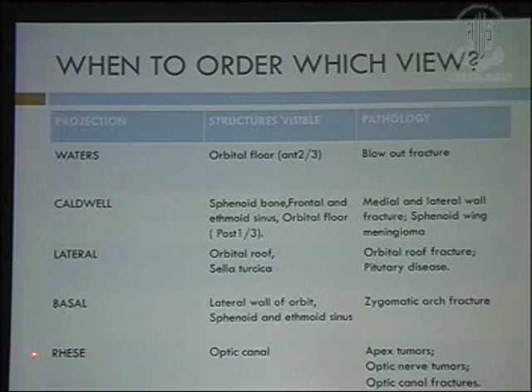And the last one, the more important, is the Rhese position, where you can see the optic canal, and it will help us to pick up the optic nerve tumors and optic canal fractures.